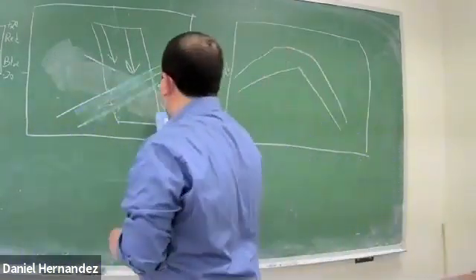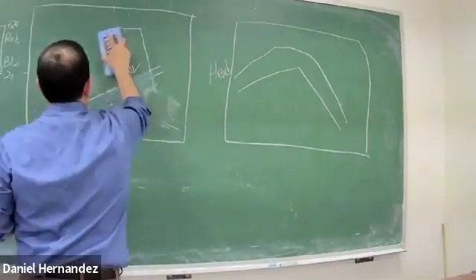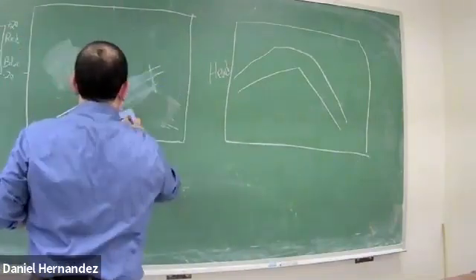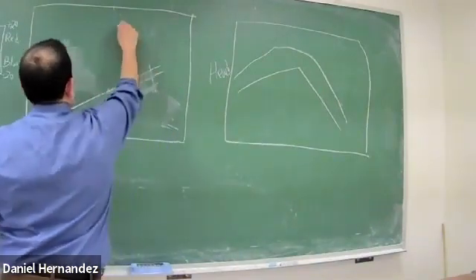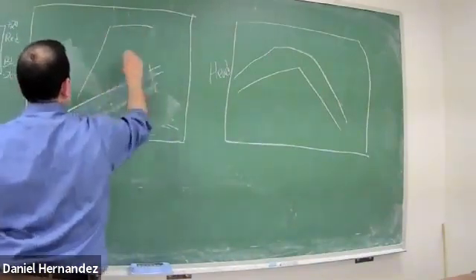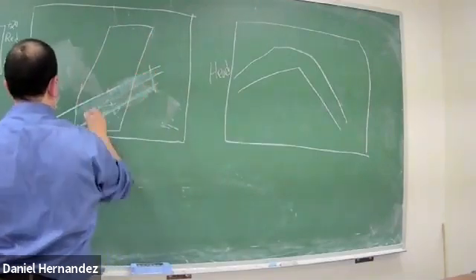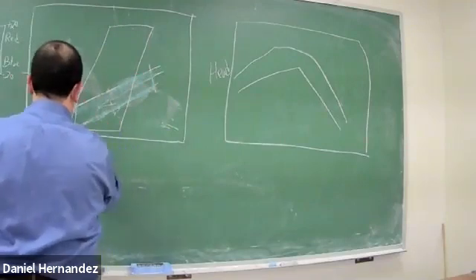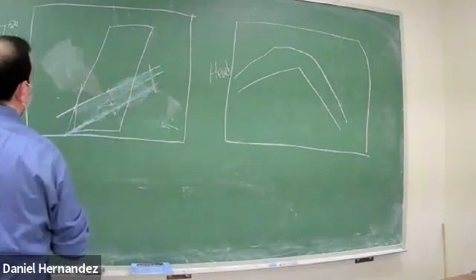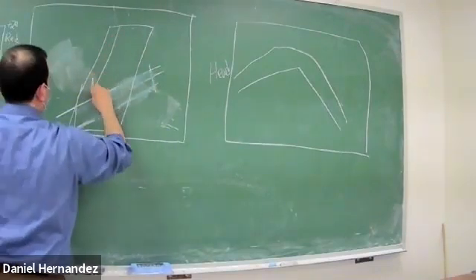But if I had that same vessel, and I steered my box in the other direction, you can see the ultrasound beam is now coming in this direction.